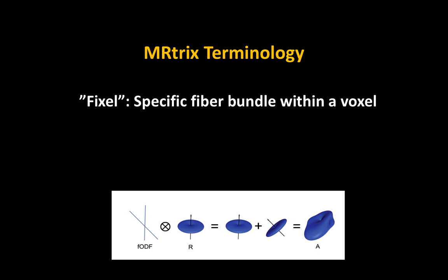How do you get more detailed information than what you just see in this grayscale intensity image? But what we do every time that we collect DWI data is we're acquiring at multiple different orientations for that same voxel. So we're getting a sense of where there's more signal loss at which orientation. So what can we then infer about what the diffusion is like, how strong it is, and then try to reconstruct what the original fiber orientations look like? And we're going to do that with something called a basis function.